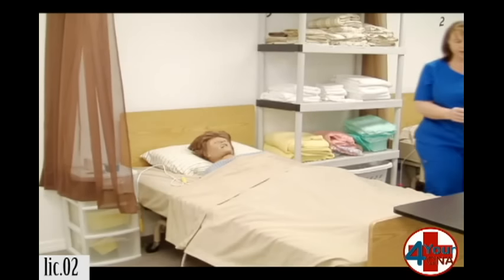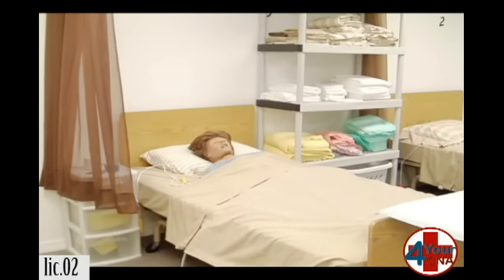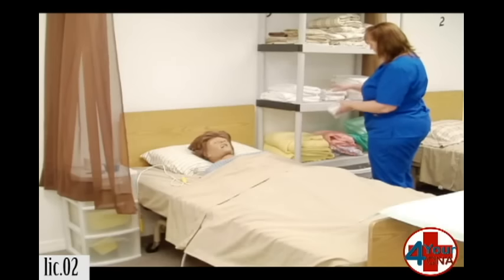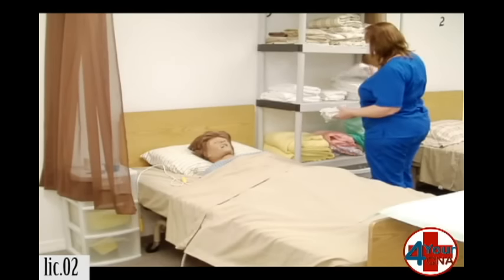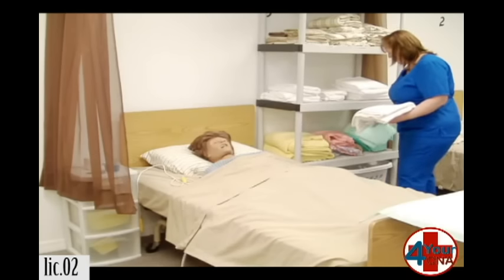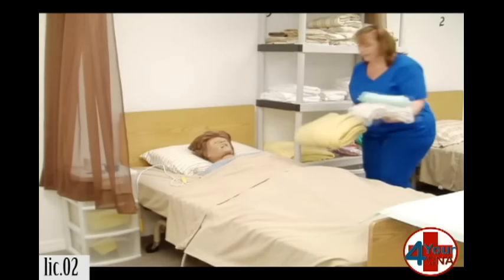I'm going to get a barrier and place it on my table so I have a clean area to put my supplies. I need four washcloths for this skill. I need a towel. I need a chucks. And I need a privacy blanket.